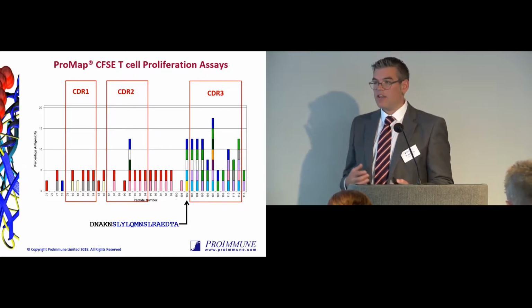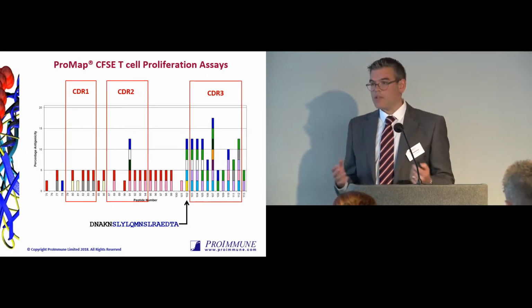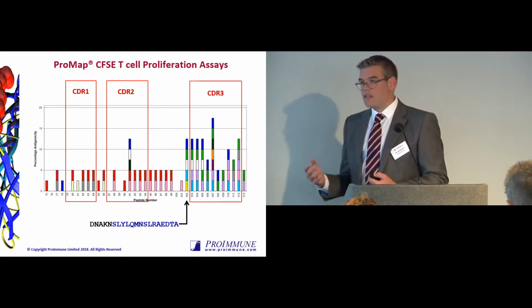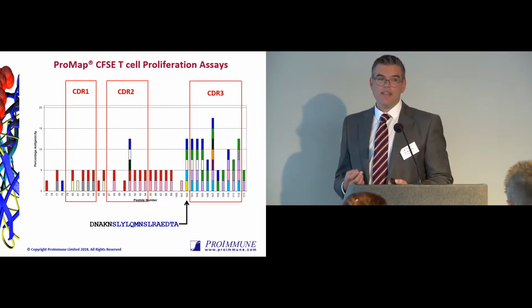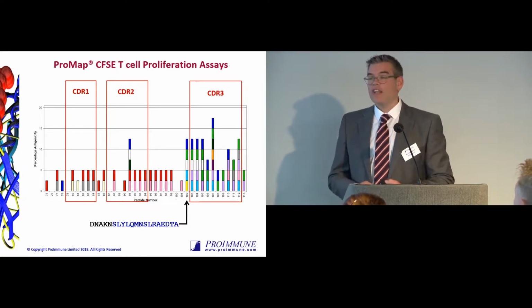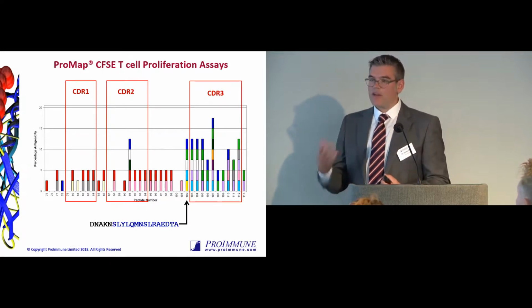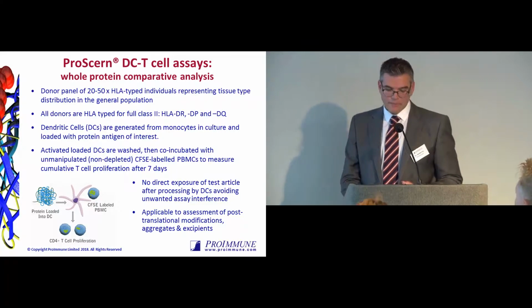You can actually see that there are typically quite common peptides that are either in the CDR domain or sometimes in the framework region, which very, very commonly come up in the antigen presentation assay. It's very interesting when you see these types of peptides that are being presented. Just a few nods, because everybody knows what these peptides are. We kind of see them a lot. They're not exactly the same sequence, but they're all a very, very similar family. And that's really just these framework peptides are very, very commonly presented. And it's very interesting to see how those all perform as well in the T-cell assays.